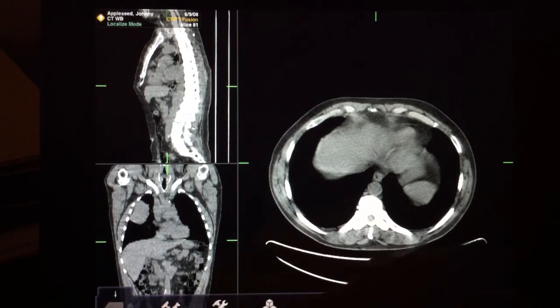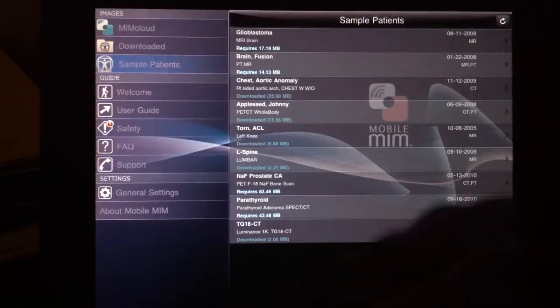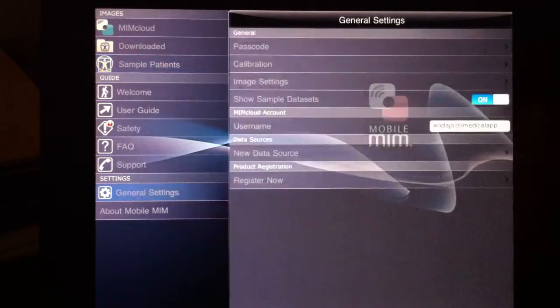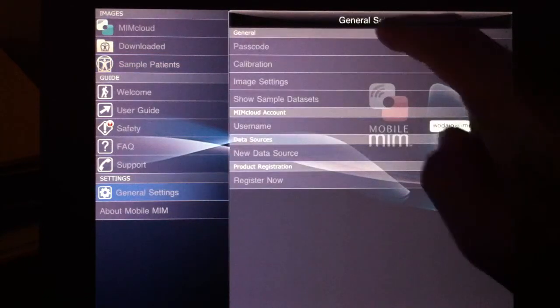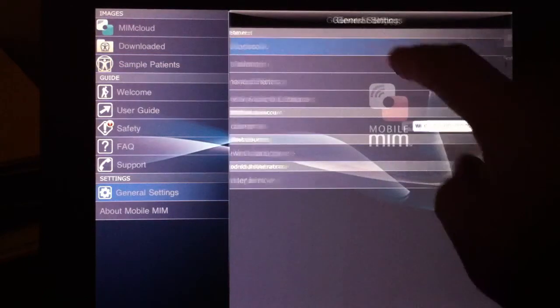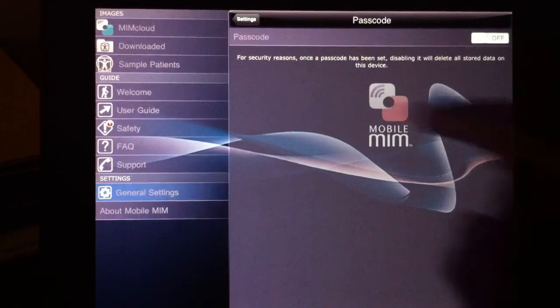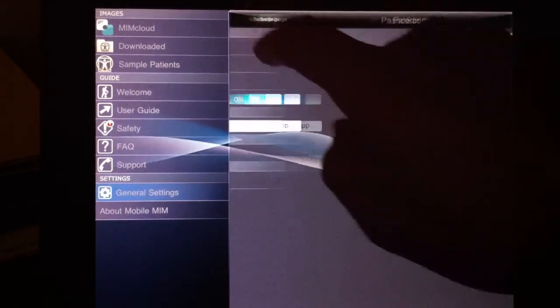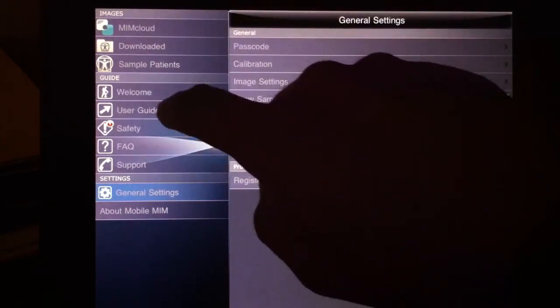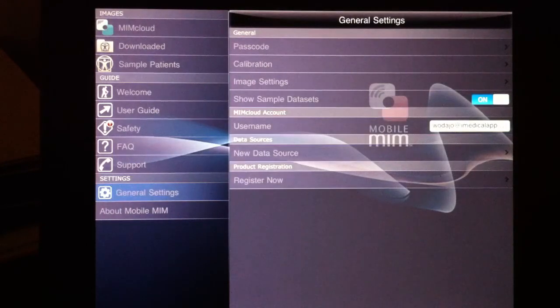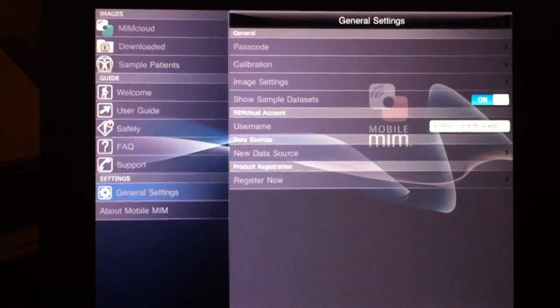Lastly, if you go back to the settings, you can set a passcode to prevent unauthorized use. The welcome and user guide are available here. And that's the end of this demonstration.